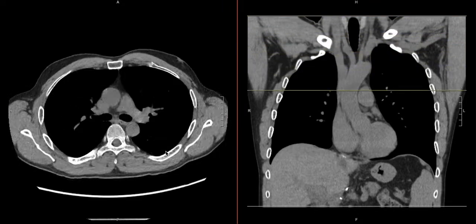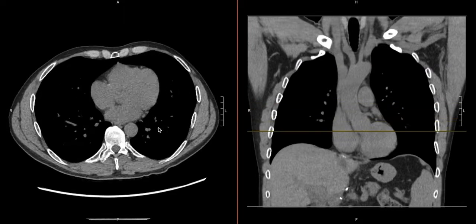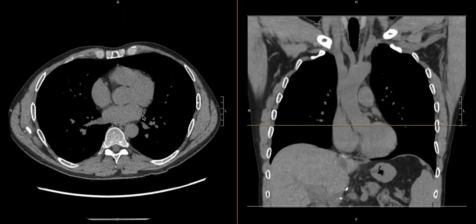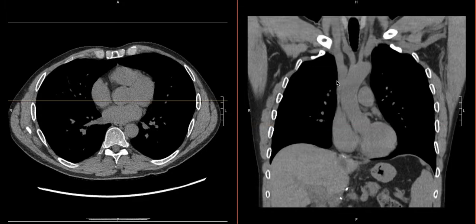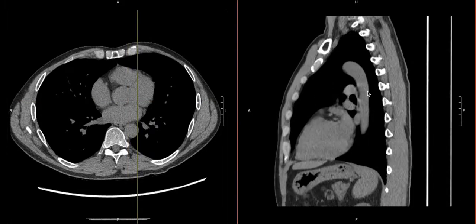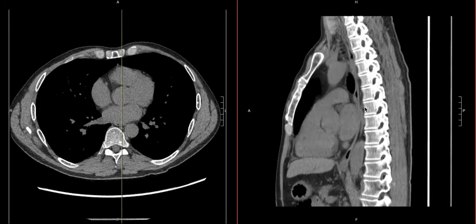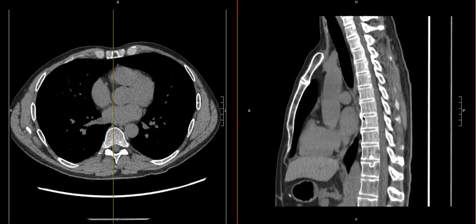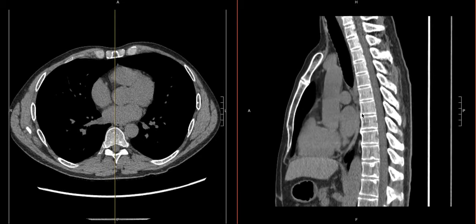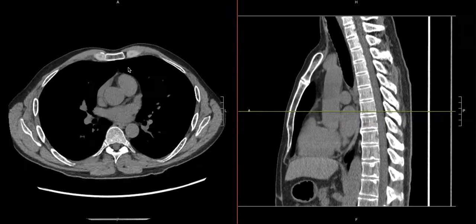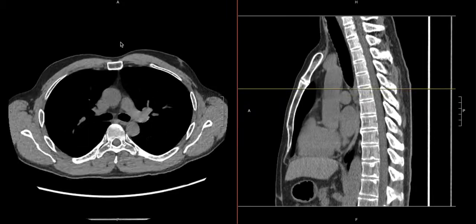Then you can go back to the aortic origin and trace down the arch. Put it on the sagittal view to get a real good look at the aorta, and if needed — if it looks enlarged — we can measure and look for aortic aneurysms.